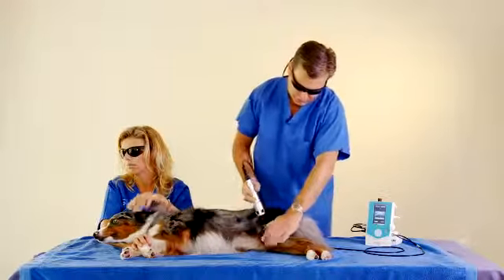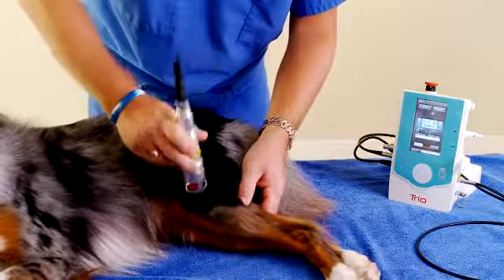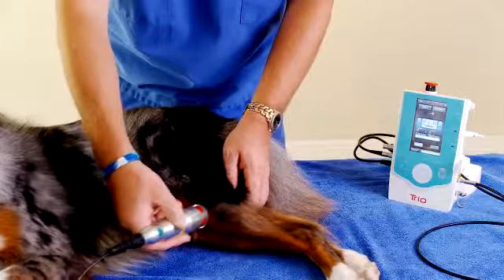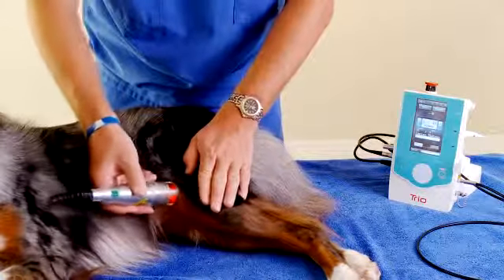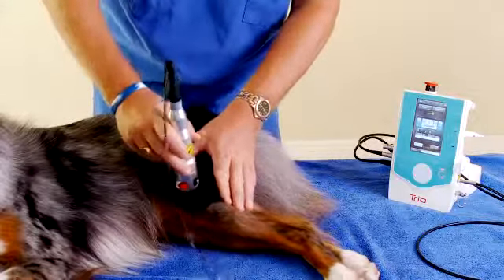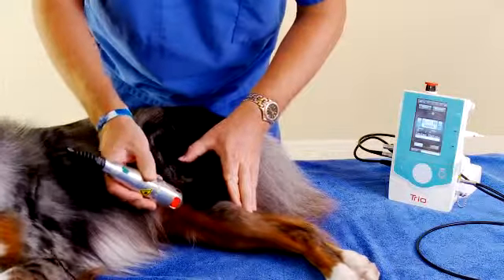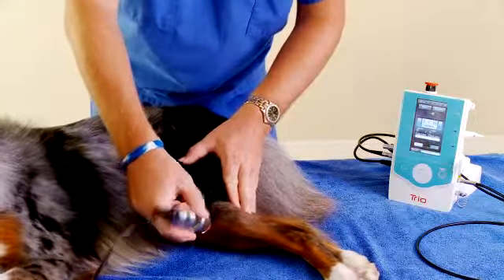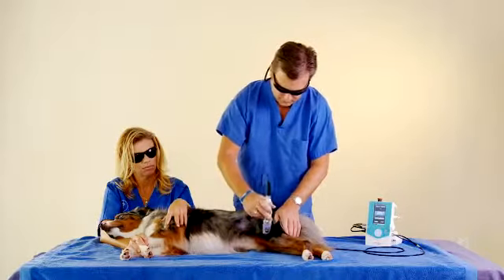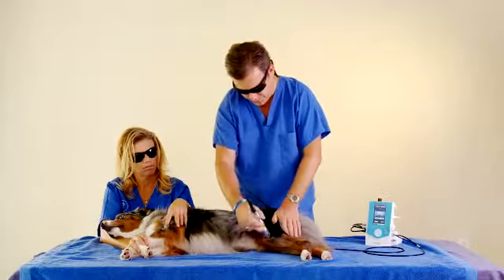And the other technique is, if this wasn't a TTA and he is arthritic, you can use a rotation technique. And again, we talked about volume. You don't need to do the underside if we're getting at the joint necessarily. You can if you want to get at an angle, but we are going about 2 inches through. So if you look at his stifle, it's probably about 1.5 inches, so we're actually coming through the other side. So you tell your technicians, unless it's thick, they don't even need to go through the other side. But to get to that arthritic joint, you can do this rotation and treat them like so.